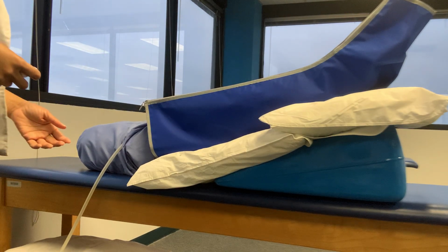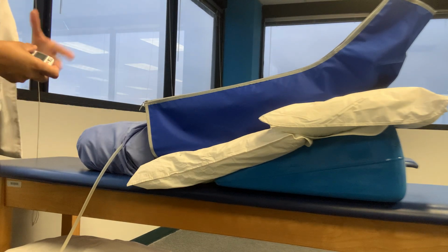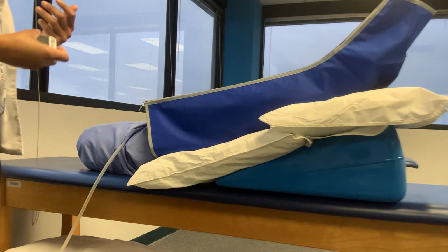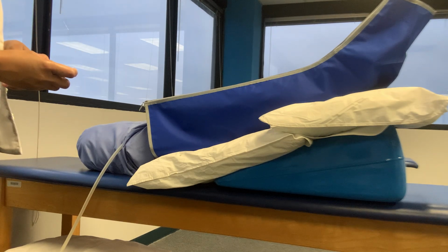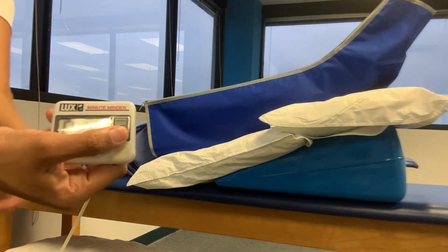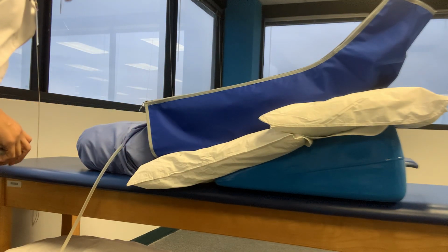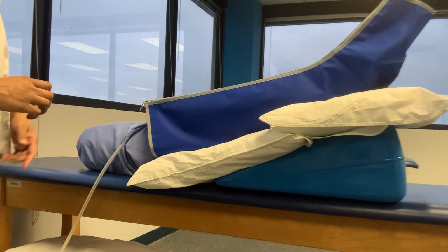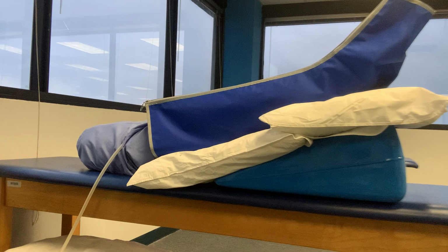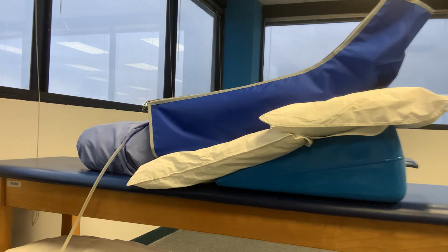So I'll let my patient know that I'm going to start the procedure. If they have their call bell, if they need anything, they know how to use it, and then I'll let them know. So this is where you're going to set the timer for your 5-minute check. So that will be, you set and start the timer for the 5-minute check. So you start your machine, you let your patient know, and you're back. So then you'll come to one of us and we'll check and we'll say, okay, your 5 minutes has ended. So this is where you do a verbal check on your patient. So, are you doing okay? We'll be back in another couple of minutes to check on you.